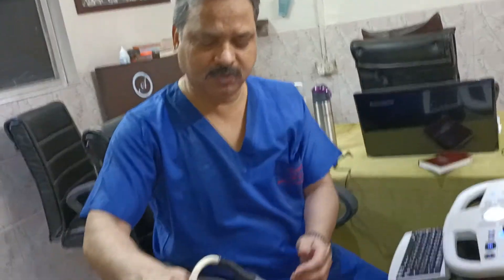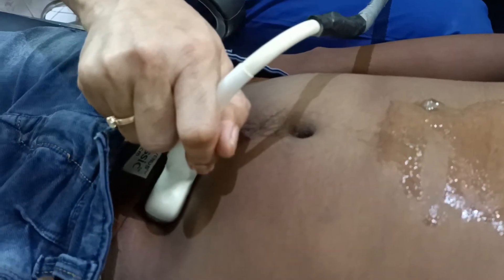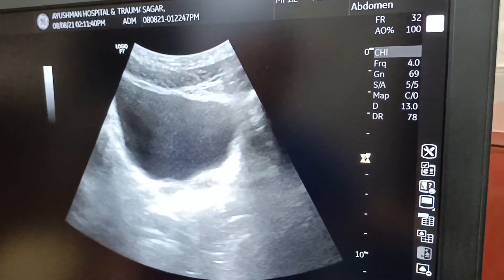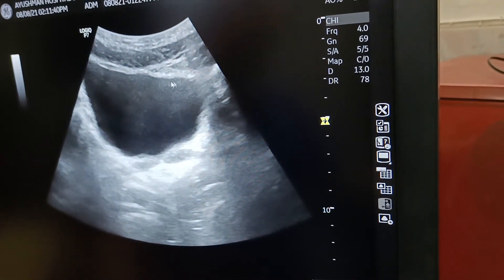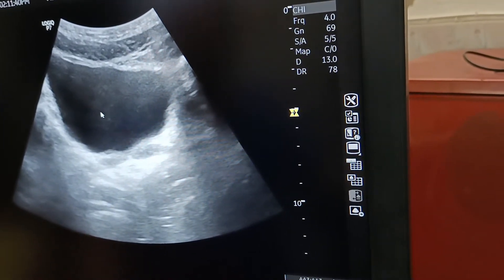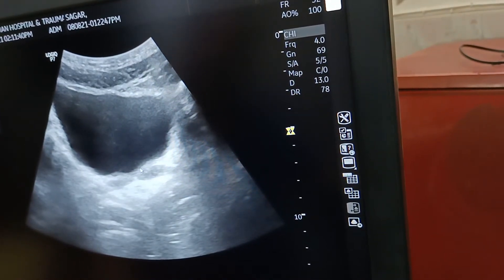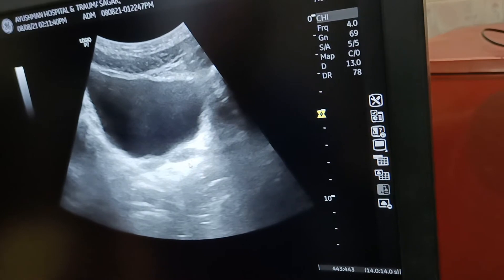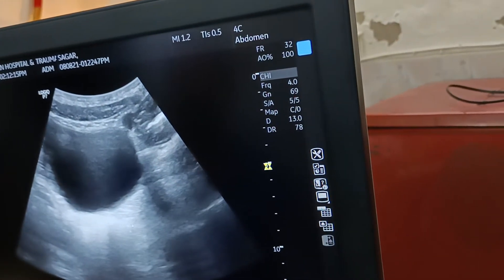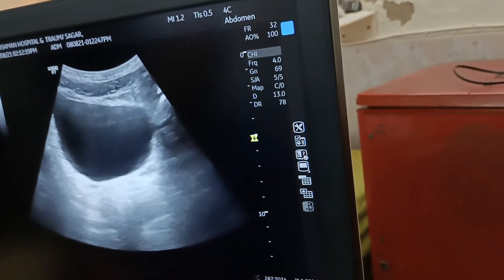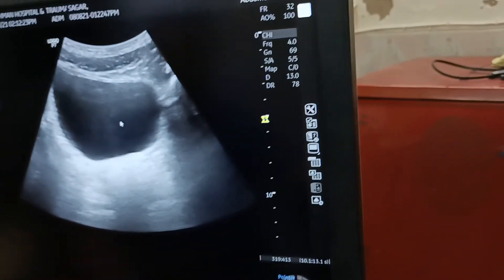Now coming to the fourth view: the pelvic view. Just keep the probe just above the pubic symphysis and push slightly toward the pubic symphysis. What you see on the screen is the urinary bladder. As the fluid appears black on ultrasound, the black thing we are seeing is the urine inside the urinary bladder. In case of bleeding in the pelvic cavity due to trauma, you will see blackening of the surrounding structures around the urinary bladder — above, here, or downward. Memorize this image, because this is a well-formed urinary bladder with urine contained inside it.